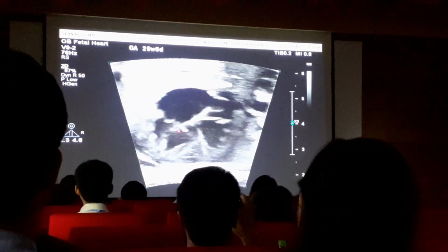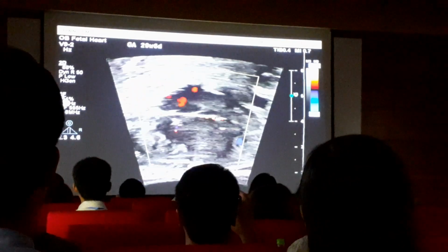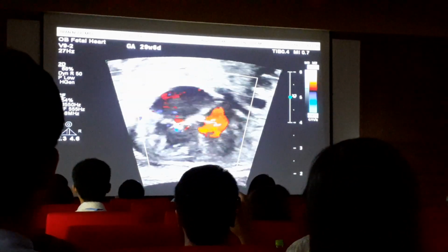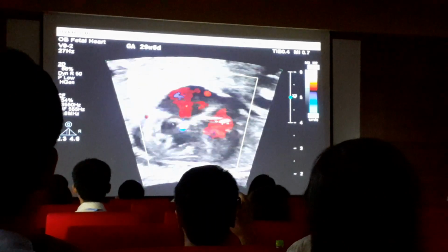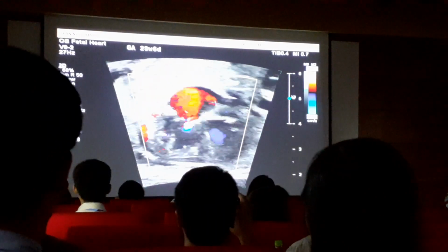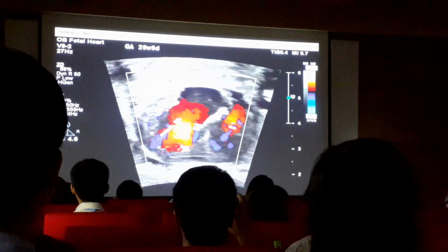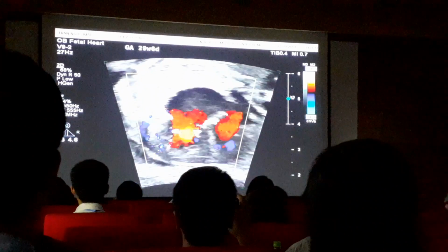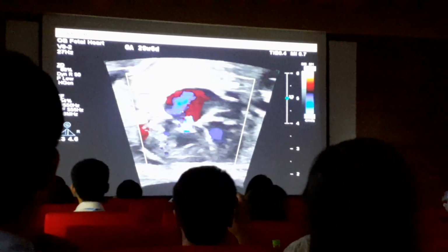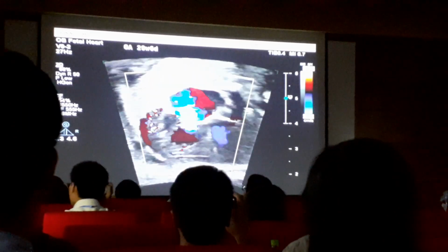Đó. So now we're going to put color here. Mình đưa màu vào. Check the variance off of the color map. Variance off. Tắt màu. Different color map. Yeah. That one. Thank you. I'm very picky.